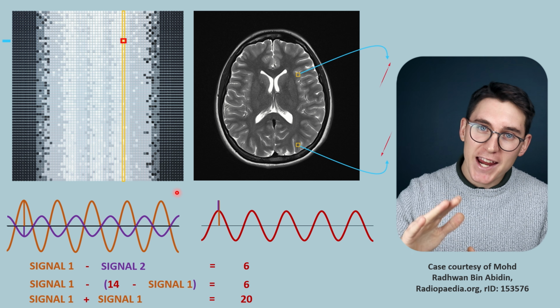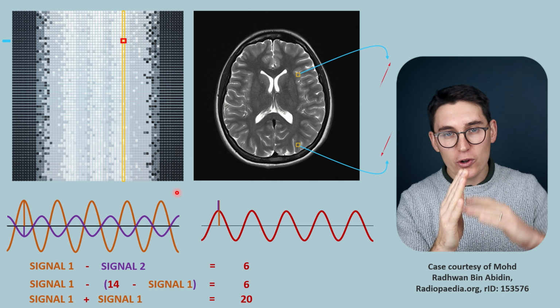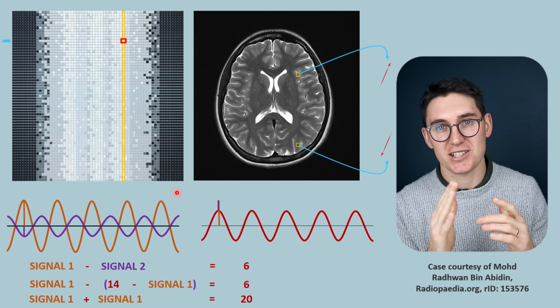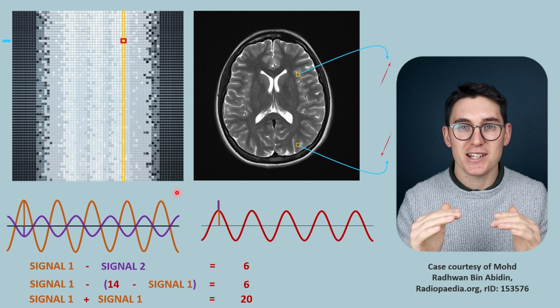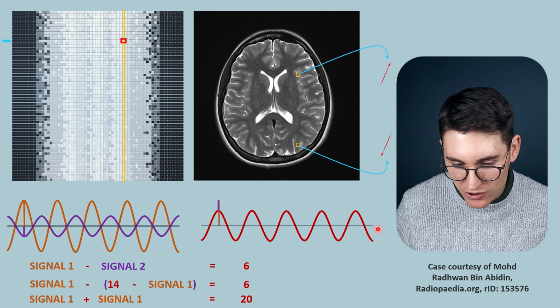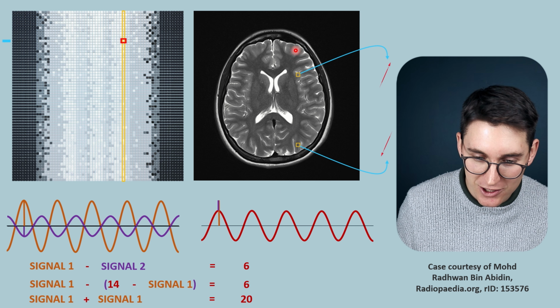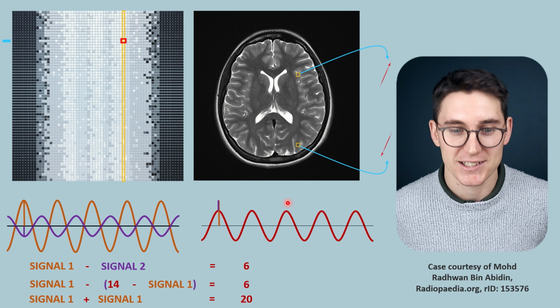Now, as we change the amount of dephasing along the y-axis of our slice, those signals coming from the peripheries of our slice will experience a greater degree of dephasing than those near the middle of our slice. And it's that degree of dephasing that we measure in this output signal that allows us to eventually calculate where the signal is coming from along the y-axis.